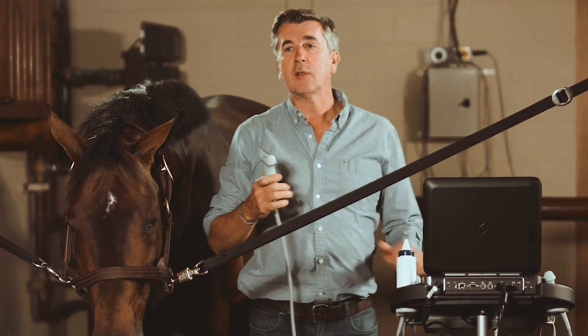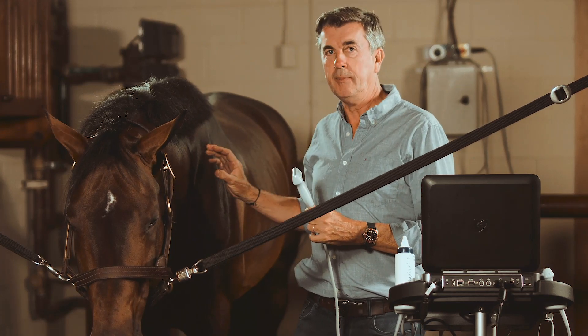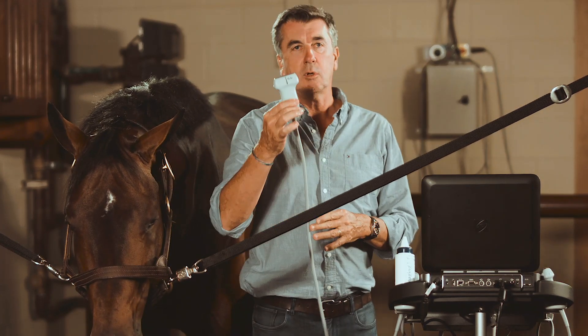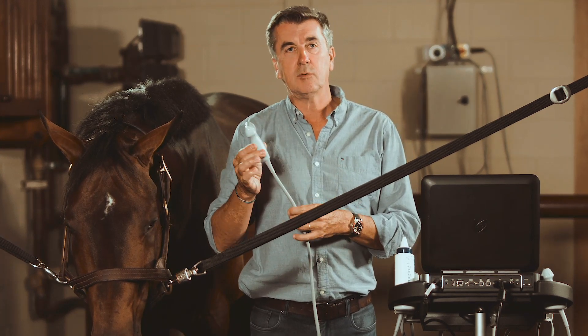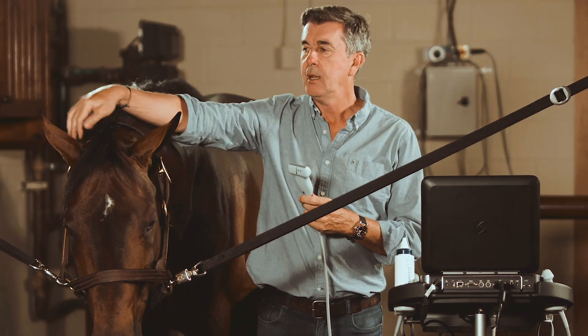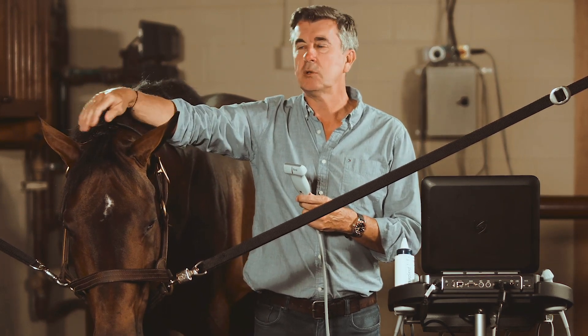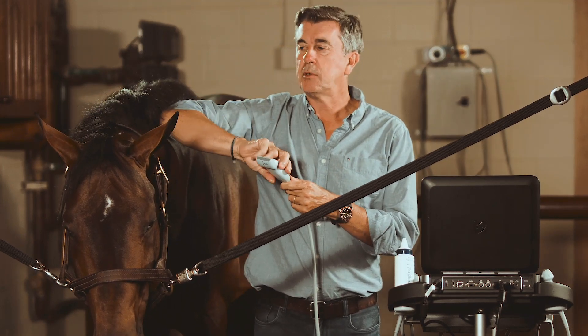To scan the neck, we can start from the poll and go down to the cervical facet of each vertebra. I recommend using a linear probe to start, which is this one, 6 to 15 megahertz, so you can have a pretty good resolution of the superficial aspect of the poll and the different ligaments and muscles inserting on the skull exactly at the occipital crest.